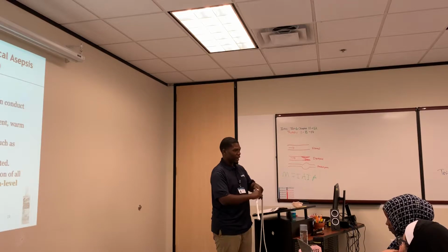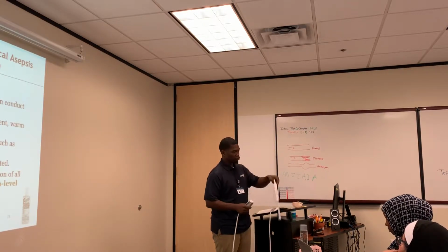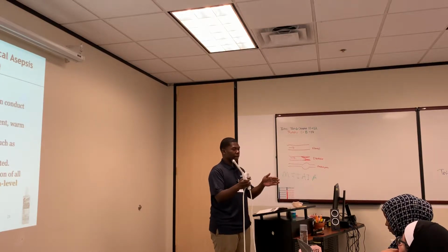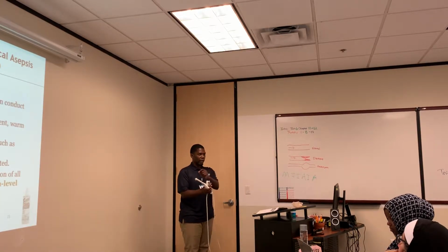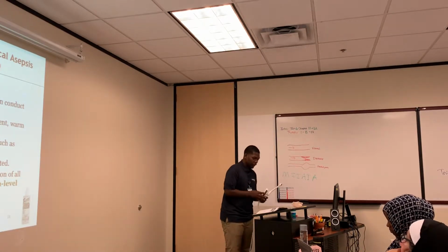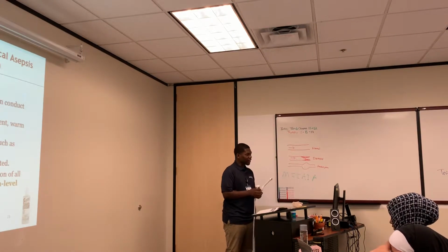But you kind of wipe it down for like 3 minutes, and then you take it to the Cidex solution, drop it in. It's a whole form that you have to fill out to let everybody know that we're using the proper medical aseptic technique to clean these transducers. And it's a worksheet you have to fill out. You guys are gonna be experts at this worksheet by the time you leave here. Okay? This is after every use? After every single use.